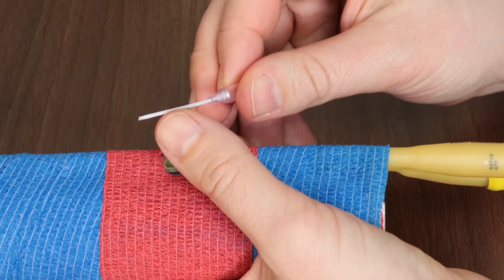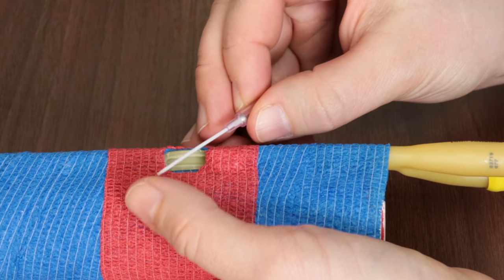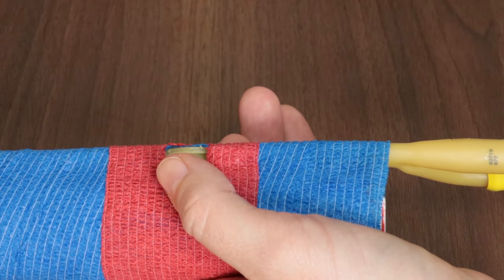So this is a really good thing to keep in mind for patient care and patient comfort, that if we did advance that catheter and there is a potential of burring, go ahead and pull that one out, discard it, and try again.